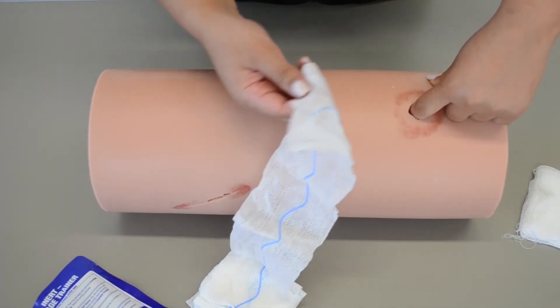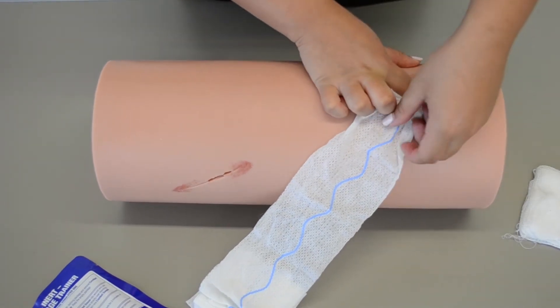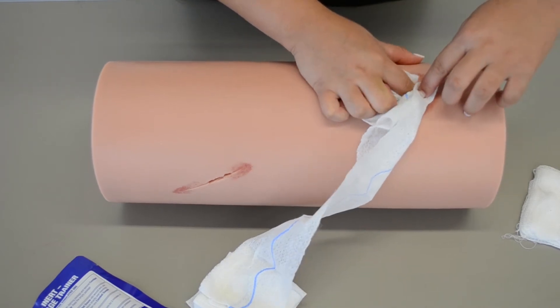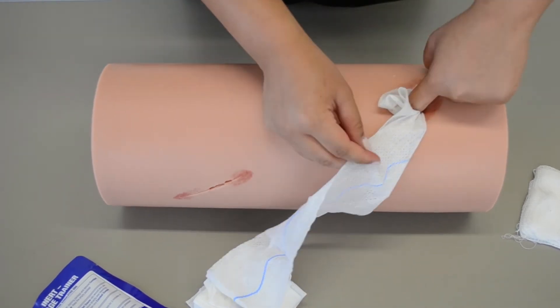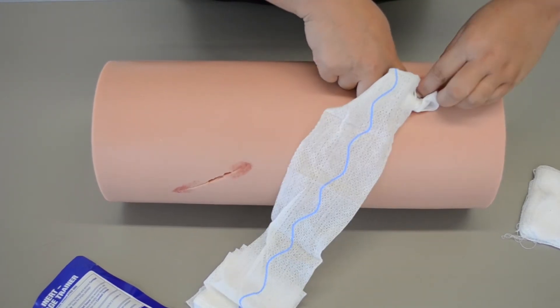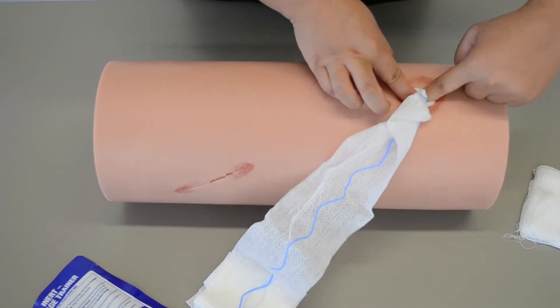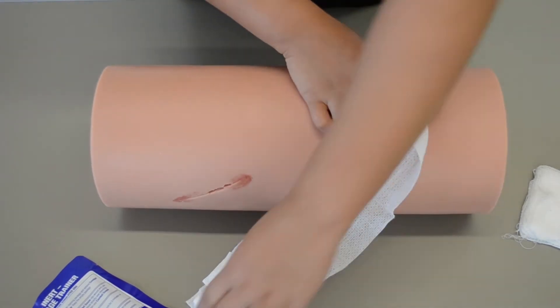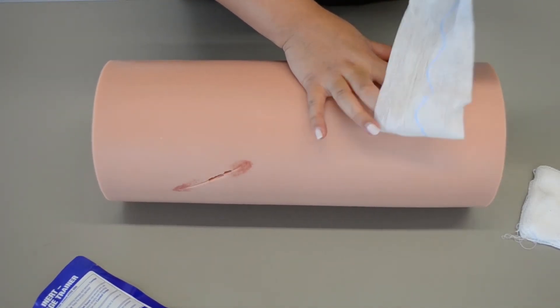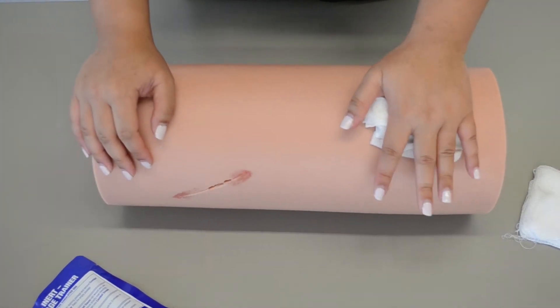Then I'm going to take my other hand, and where my finger was, I'm going to replace it with my second finger — just keep alternating fingers until I pack the wound full. I'm never going to let go of my finger on that bleed. Once the wound is full, I'm going to take the rest of the combat gauze and hold direct pressure for three minutes.